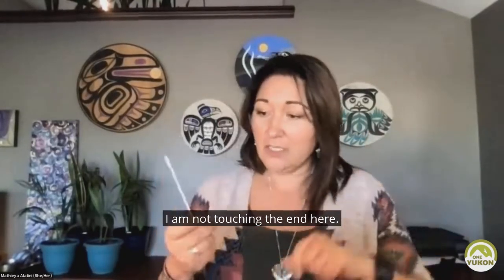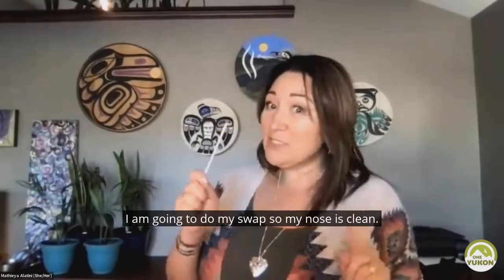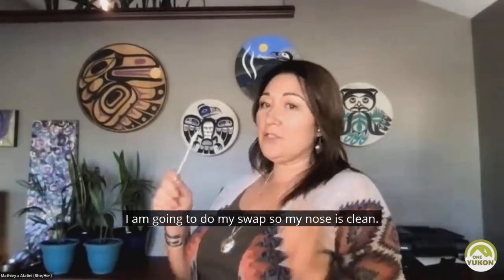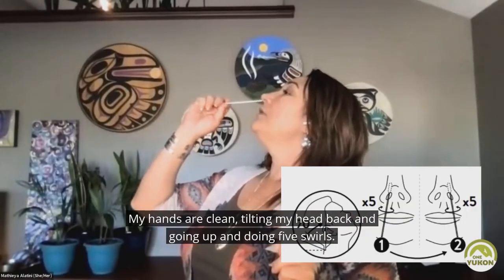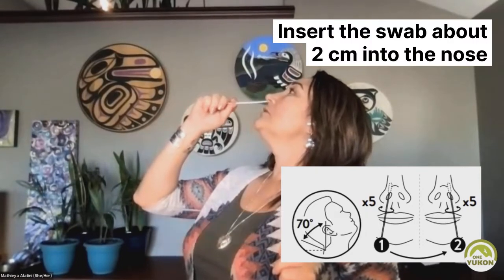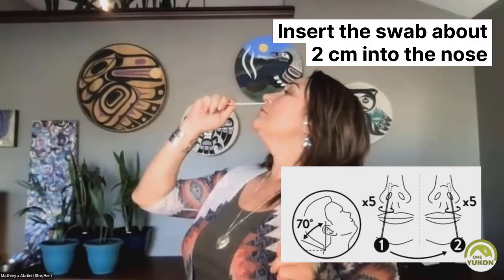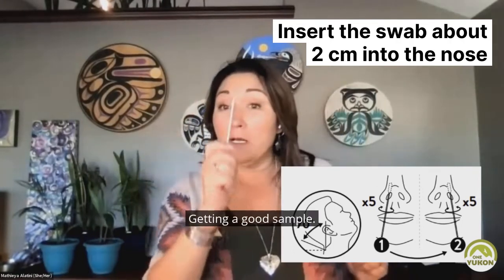It's nice and clean. I am not touching the end here. I am going to do my swab. So my nose is clean, my hands are clean. Tilting my head back and going up and doing five swirls — one, two, three, four, five. Getting a good sample.